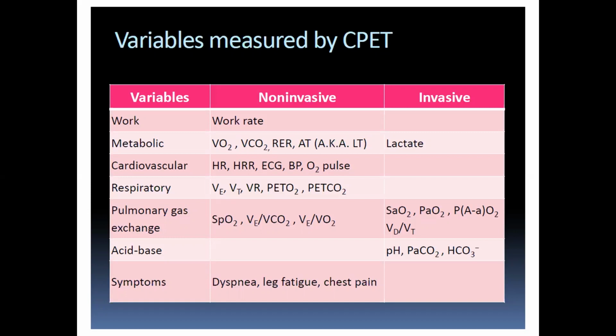And then it just detects how much carbon dioxide is being exhaled during expiration. So it's just measuring those two parameters, and then when it multiplies by the frequency and tidal volume, it can tell you the maximum minute ventilation. But really, that's all it's doing.